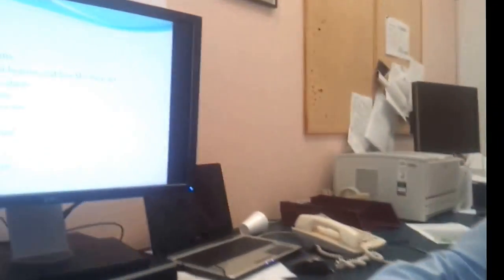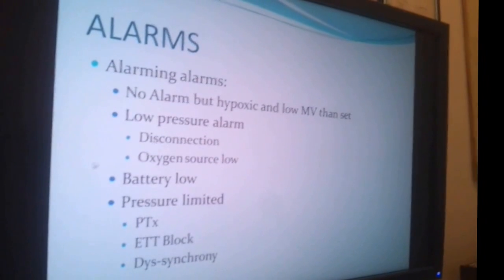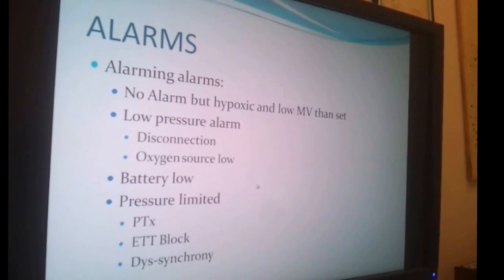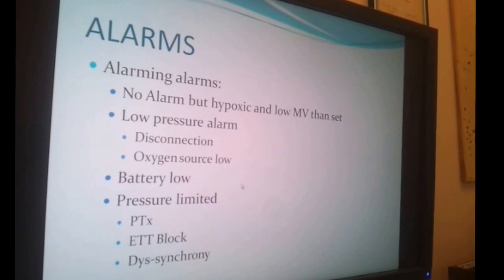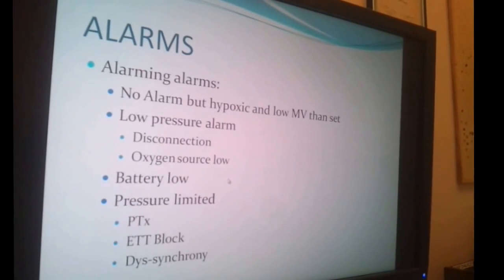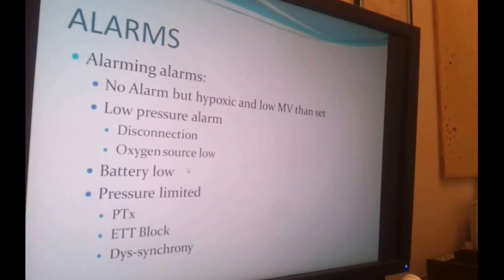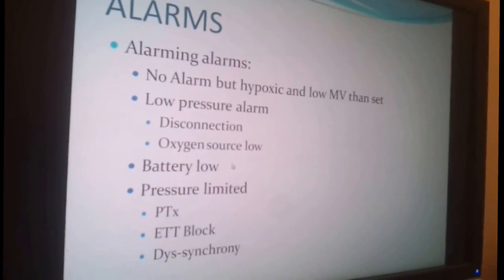Battery low is again a big problem. If you are going for a CTA or a chest, abdomen, pelvis, head CT with contrast, it's probably best to take the power source with you and plug it in, rather than depending on the battery. The battery will usually last a good half an hour, but if the machine is old, as you know, mobile batteries don't last that long when the mobile is old, so these won't last that long either.